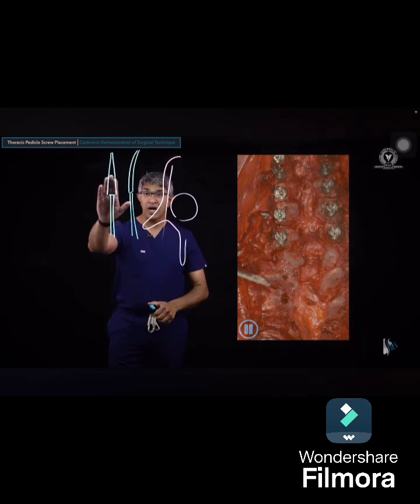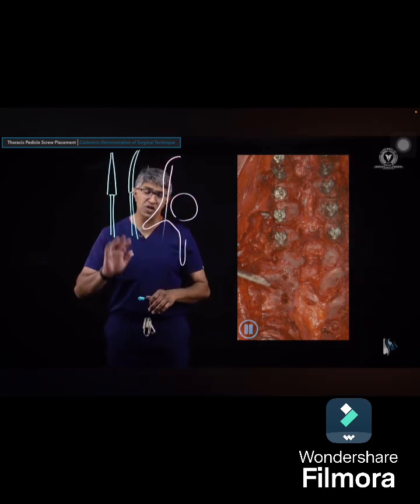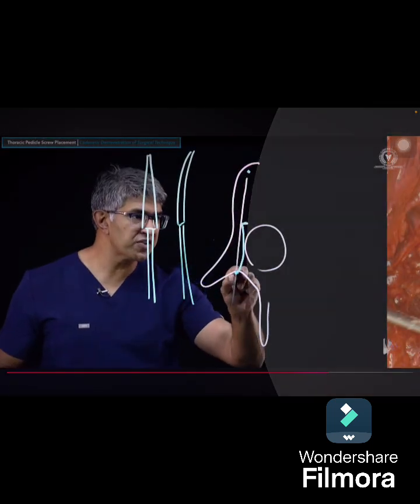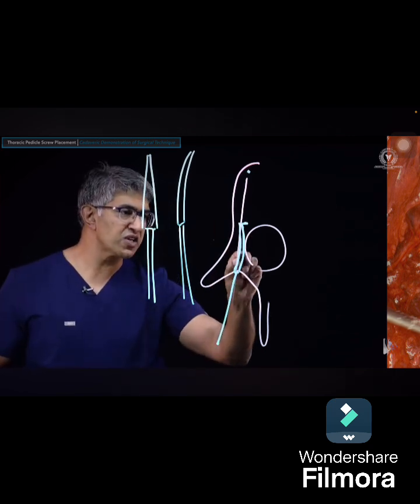gear shift. Now, I tend to use a straight gear shift and feel my way right down the center, but some people like to use a curved gear shift. Let me talk a little bit about how that is done. When you're putting in your curved gear shift, let's assume that this full depth is about 30. The bevel, so to speak, the convex surface of it, ends up being medial. So you put this in and imagine that this is the convex surface of it.